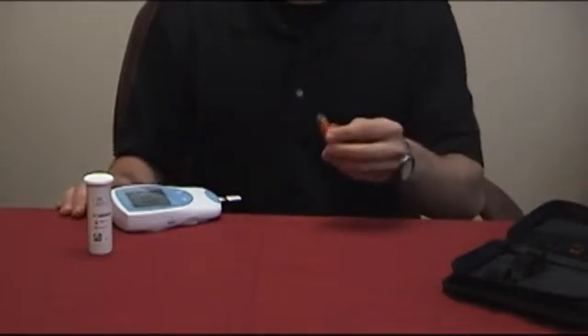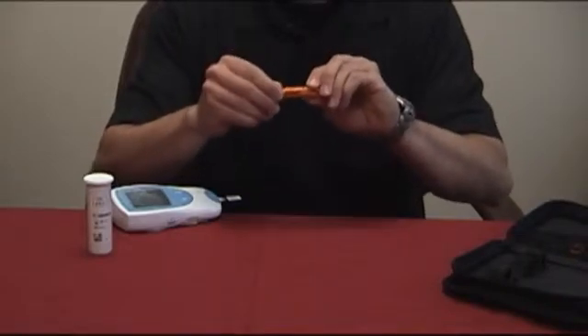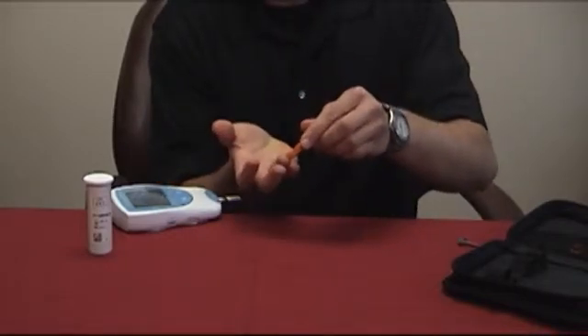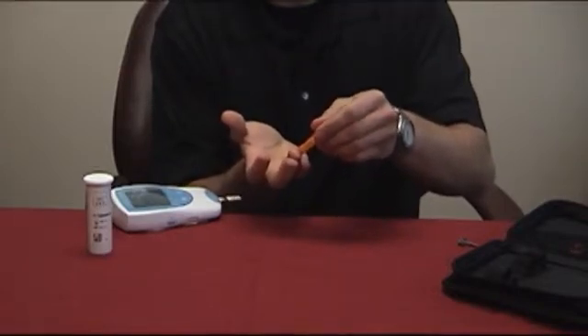Now take your lancet and twist the gray cap a couple of times until it comes loose and pull it out. With your palm facing up, press the lancet against the fleshy side of your fingertip, making sure that it's flush with your skin. Simply push the lever to engage the lancet.